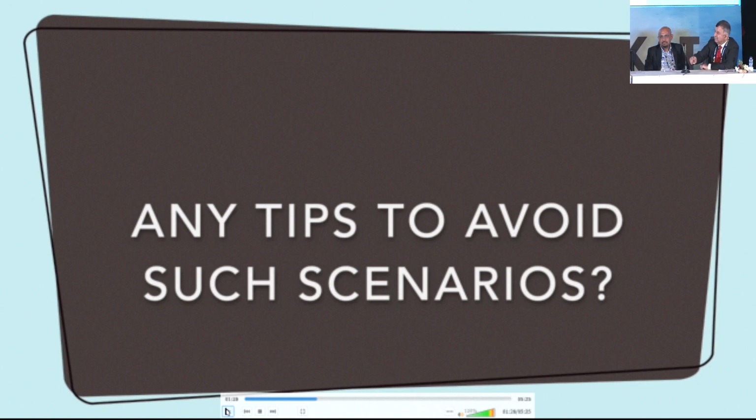One is, as cataract surgeons, we want to think of the cataract, or that's how our brains work. So if possible, put in a lens quickly and just be done with it and come out, because the surgery has been done well. There is no rent. The CCC is also perfect. So putting in a one-piece IOL shouldn't take more than about 30 to 60 seconds. But if you think that the bulging is too much, then as Sir says, if we have taken an IV access, we can perhaps give IV mannitol on table. That will make the vitreous less turgid and make it faster.